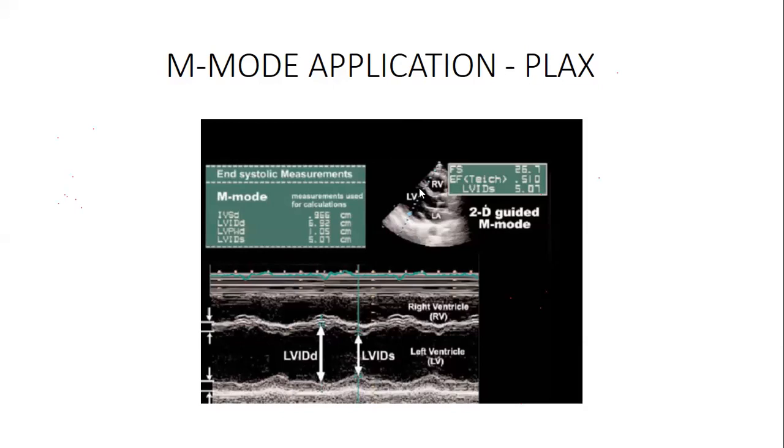We are at the ventricle. Still, we have a bit of the right ventricle there. And then this one is the septum, the IVS. From there, coming down up to here, this is the left ventricle.